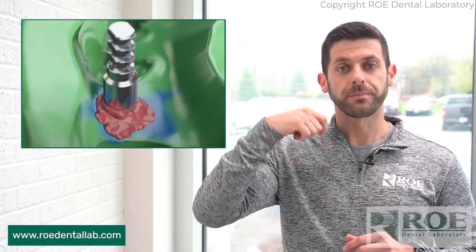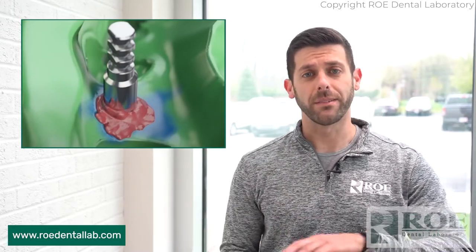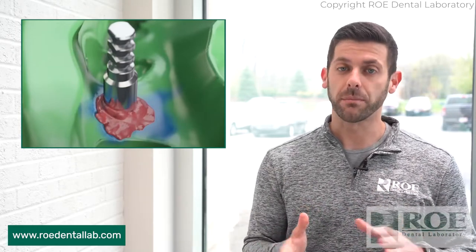Unscrew it, remove it, and send that to the lab. Please make sure you don't rip it out of there, because that creates a whole other problem and we're going to make something terrible for you. So unscrew it and send it to the lab. One little reminder on the closed tray: sometimes we'll get impressions with no impression post. That's going to hold your case up. So please make sure on the closed tray you remember to send that post to us.